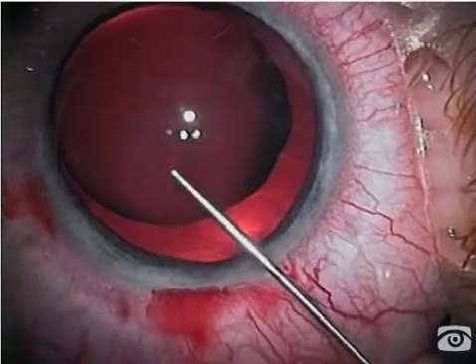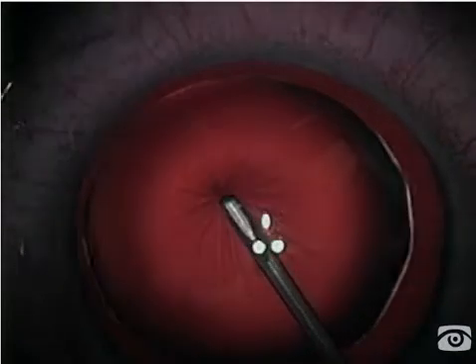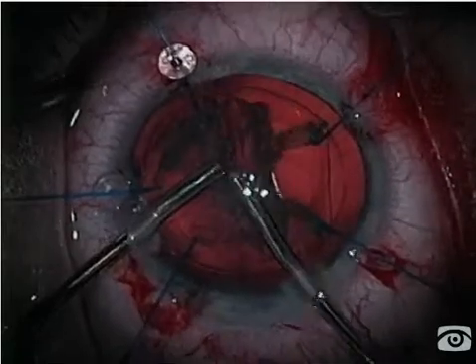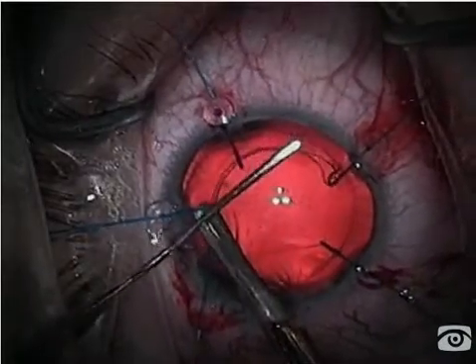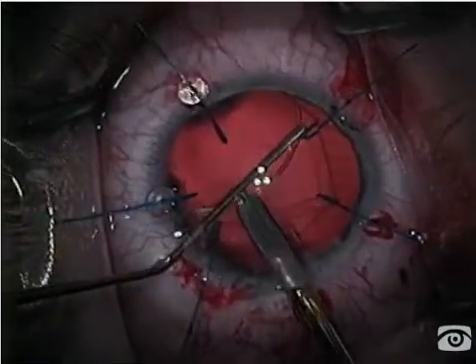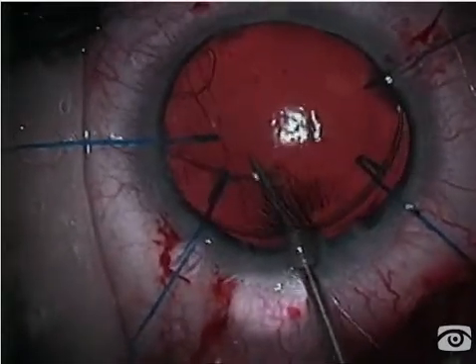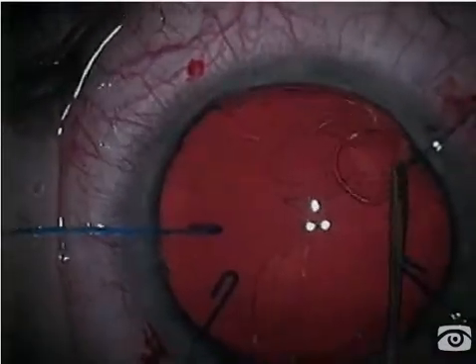Let's review the same steps in the other eye, which was done one week later. Again, the chamber was extremely shallow, the pressure was uncontrolled, and surgery was scheduled somewhat urgently. We perform the same step of completing the capsulorexis, using multiple iris retractors to fixate the capsule, using a second instrument to bend the ring because it is so large to let it drop into the capsular bag, and then using suture fixation of a Sioni ring on top of this, so that the entire capsular diaphragm doesn't tilt forward and literally be captured by the pupil.